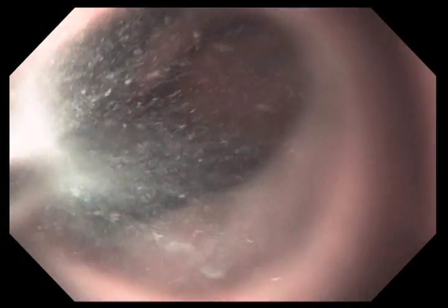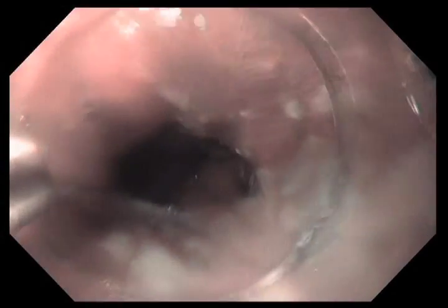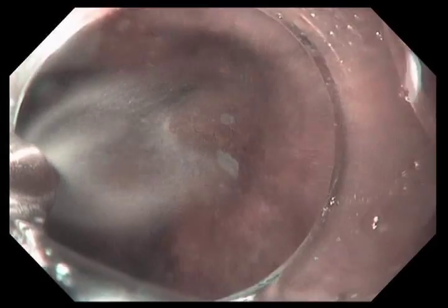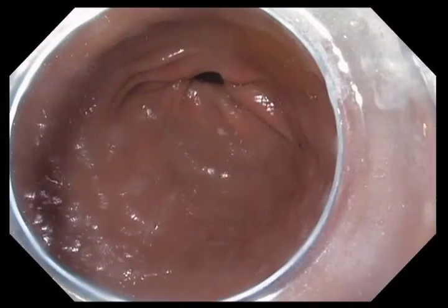Now we're washing the Barrett's epithelium with mucomist. Columnar epithelium produces mucus, and mucus prevents adequate contact between the radio frequency device and the mucosa. So we're using a spray catheter to spray on mucomist, essentially to dissolve the thin mucus layer.